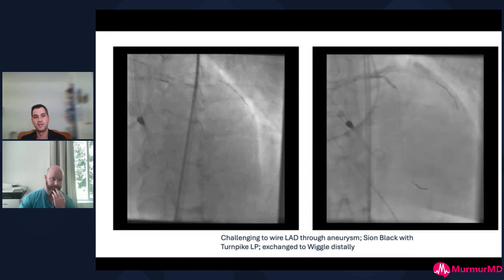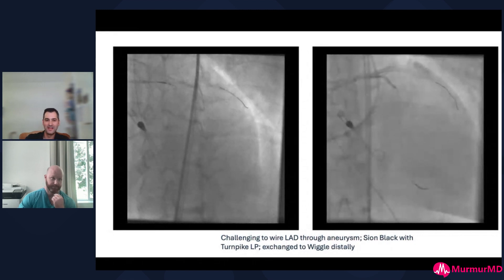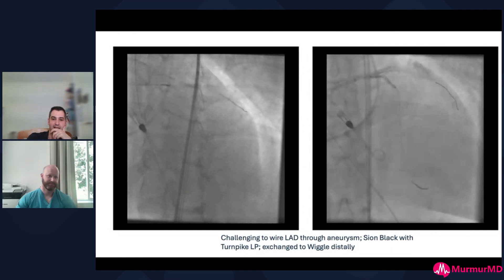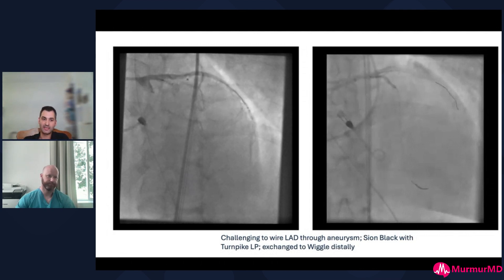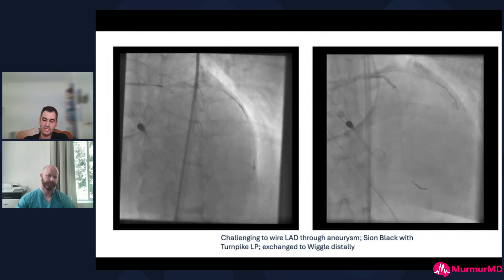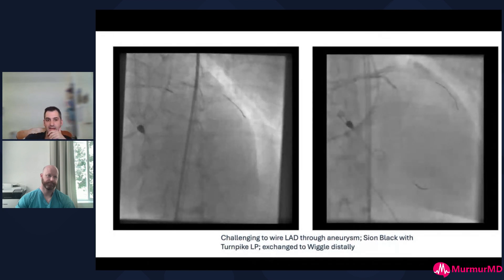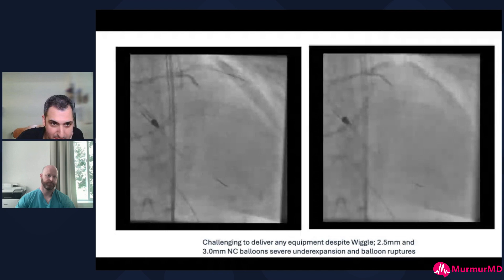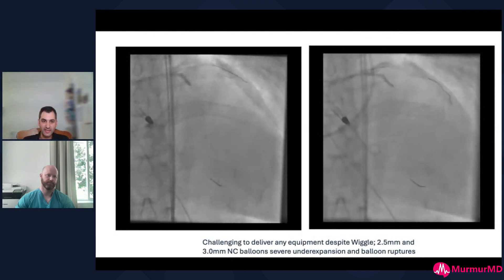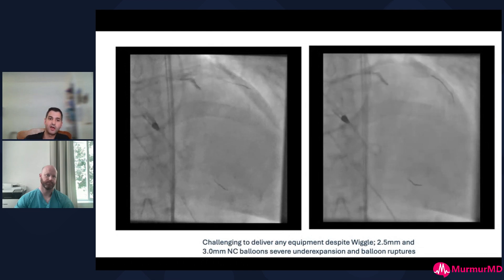Then we went on to treat the LAD. The first panel was an embarrassingly long fluoroscopy time of me trying to wire that aneurysm — it took an incredibly long time. Eventually we found a path down with the Sion Black and a microcatheter, exchanged that to a Wiggle wire. Honestly, to my surprise, it was really difficult to deliver anything. I hadn't quite appreciated how calcified it was — 2.5mm and 3.0mm NC balloons were rupturing. Really gnarly calcium there. Bigger NC balloons showed very severe under-expansion around the aneurysm.